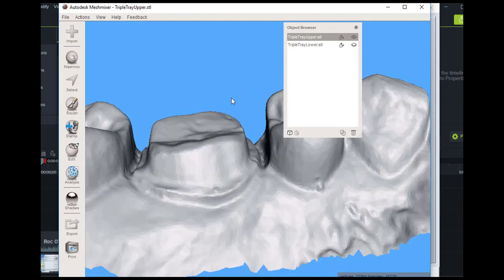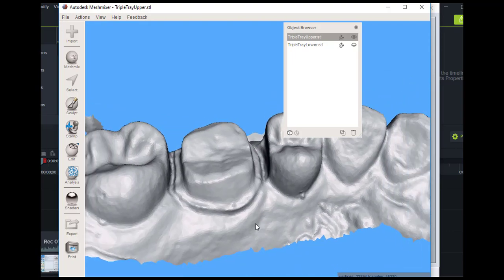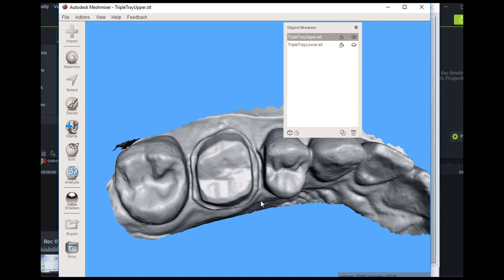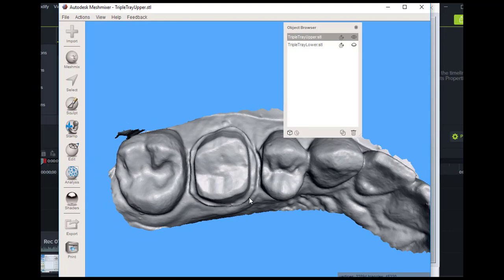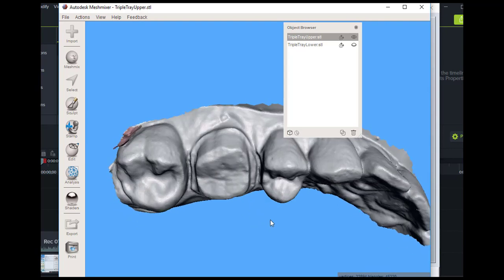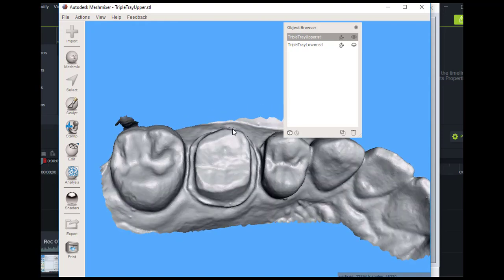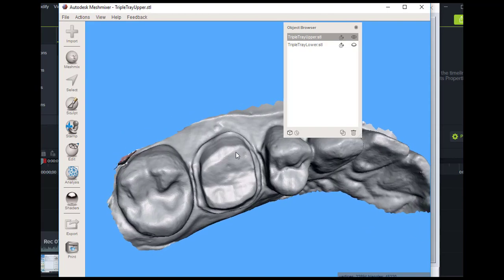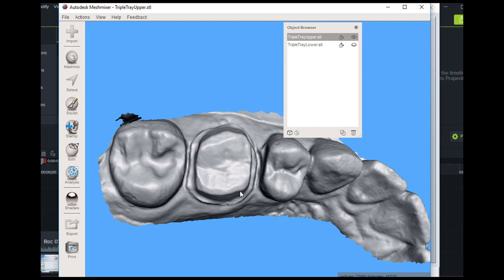This will be very easy to now take into Blue Sky or ExoCAD or 3Shape and go ahead and design the crown. So a very simple process that can allow you to really quickly make up the investment on your scanner by just doing your crowns digitally. Most labs are going to give you a price break on having your crowns fabricated off pure digital data as opposed to having to do all the model work, and so this can expedite your turnaround time as well as save you a lot of money, and it's just an easy process.